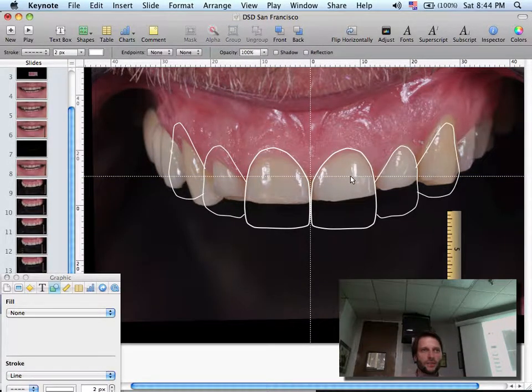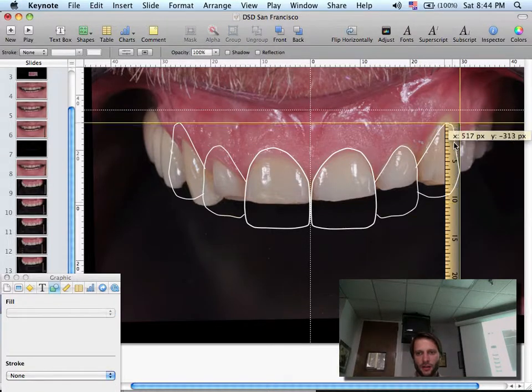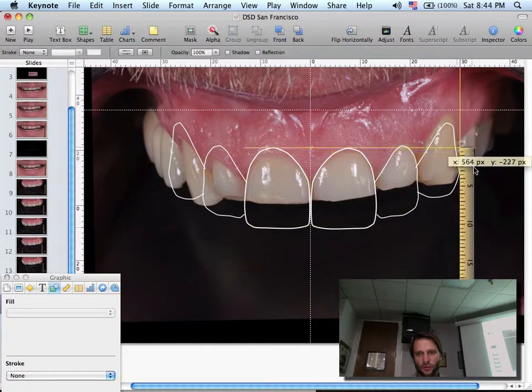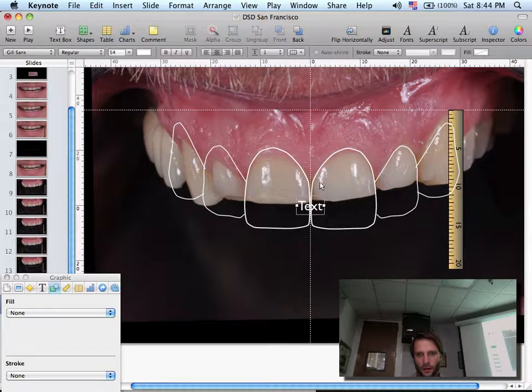If we are intraorally, we do differently. We place above the teeth and we're going to measure from here to the cervical, here to the cervical, and here to the cervical. It's not the cervical of the drawing, it's the cervical of the actual position of the gingival margin. Then I'm going to measure the discrepancies, the cervical discrepancies and the incisal edge discrepancies. So let me do that quickly. So let's say here, all the numbers that the technician needs.